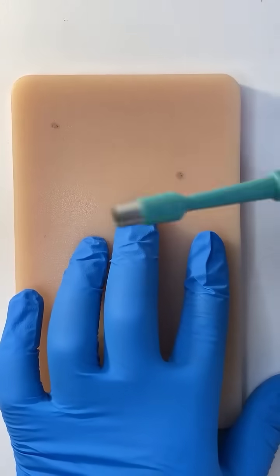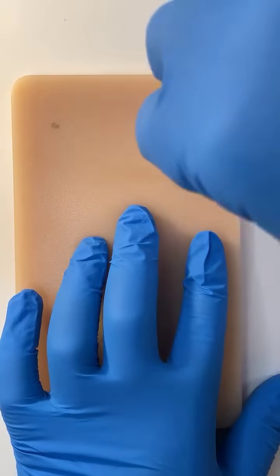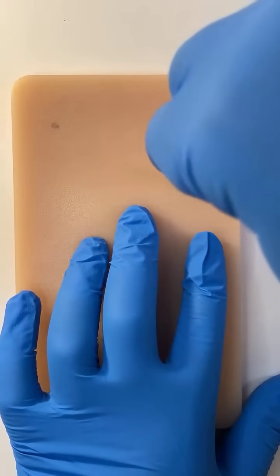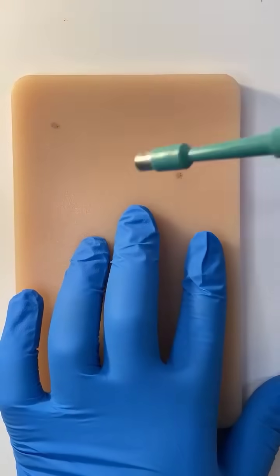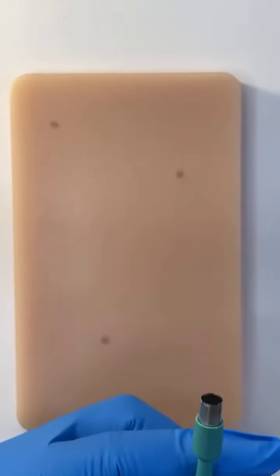All you have to do is place the punch with the cutting rim on top and twist, like so. Depending on how thick the skin is, it decides how deep you go with your biopsy.